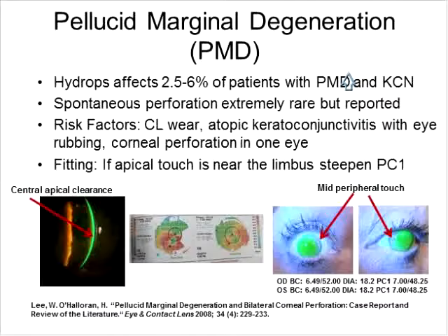The next question is, what scleral lens companies will do a front toric on scleral lenses? I know the Boston Foundation for Sight can make very custom lenses, but let me ask Mindy first, do you know specific companies that can put a front surface toric on a scleral lens, since you had that one photograph of the scleral lens, the toric markings?